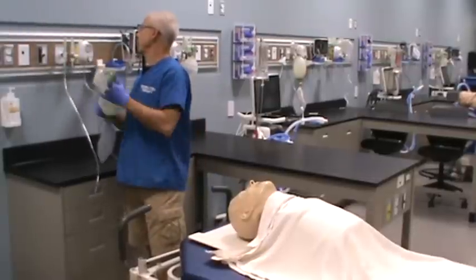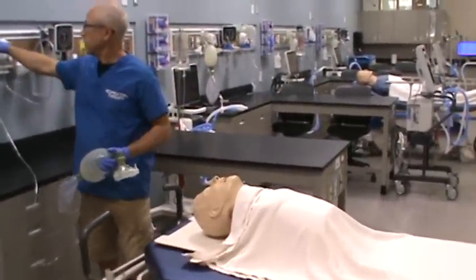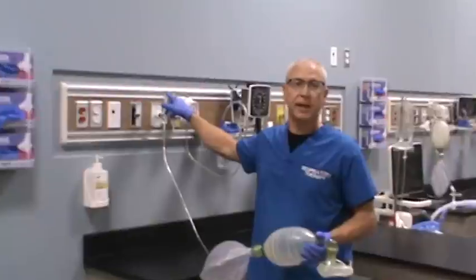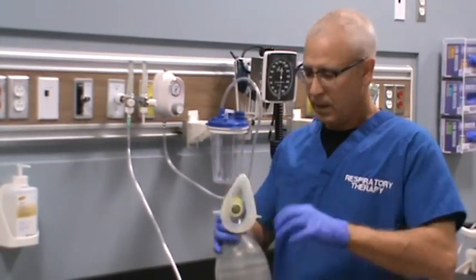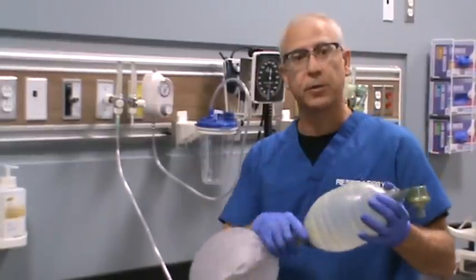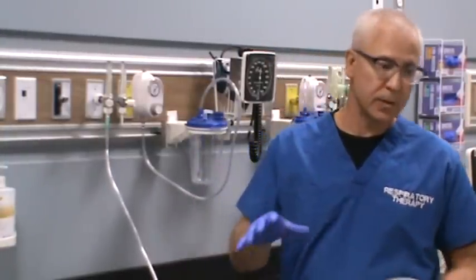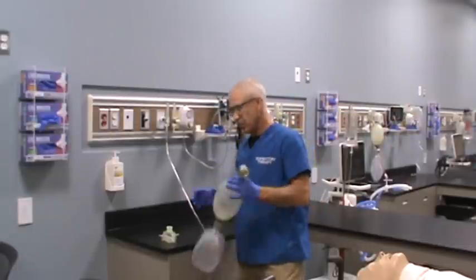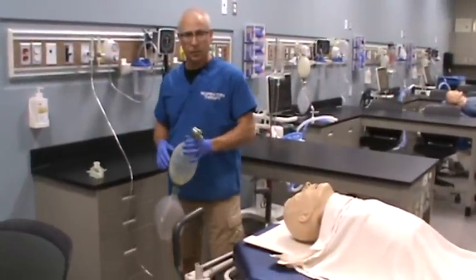Grab the manual resuscitator and turn the oxygen on. When the ball in the flow meter goes beyond the highest setting, we call that flush or full line — the flow will be in excess of 15 liters per minute. Pressure test the bagger — no leaks. It's important to ensure the bag stays distended, but not too distended, so you may need to adjust flow. You want the bag distended while ventilating to give your patient maximal FiO2.